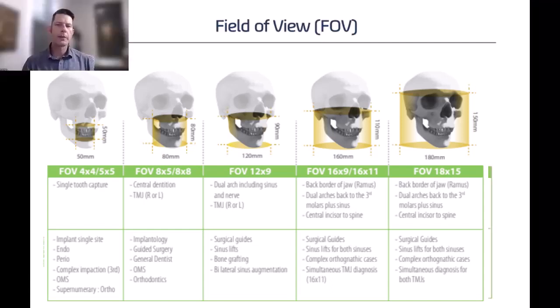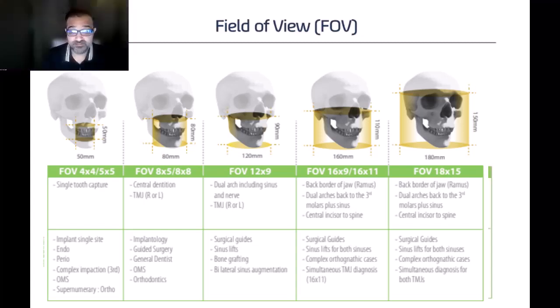Let's talk a little bit maybe about the 12 by 9 field of view here. Absolutely. No, great point that you mentioned, James. I appreciate that. And the whole thing is that you want to acquire what's absolutely necessary.